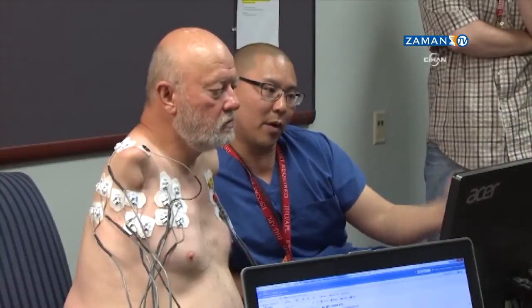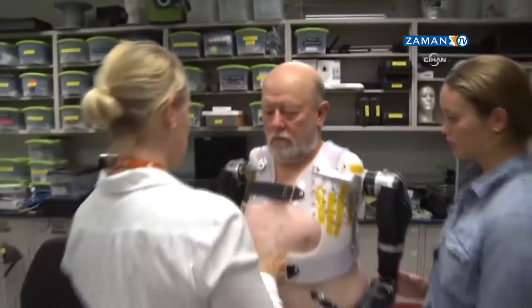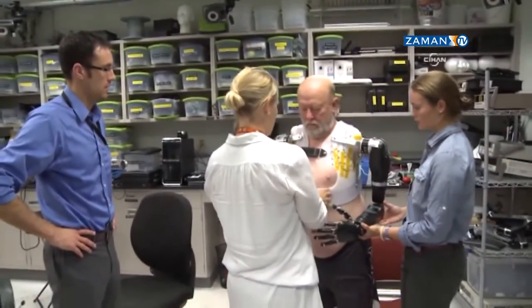Let's do some elbow. Elbow up. A couple days later, the socket was back and the arms were attached.